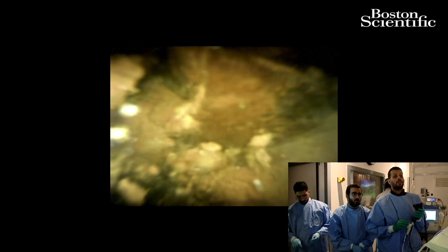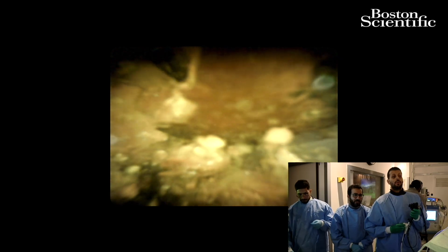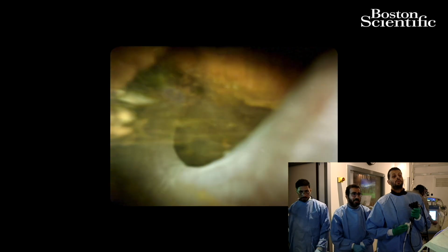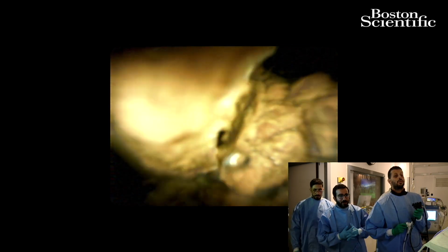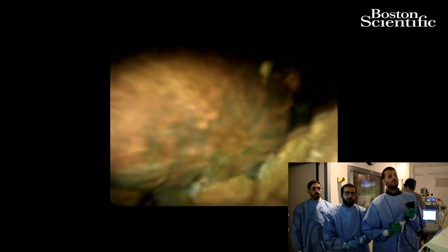So we are now almost at the bifurcation. I think we can see the beginning of the bifurcation here. Yeah. We'll just try to see whatever fragment we have here. Yeah, so that's the bifurcation. I think it's all now fragmented. So what we can do is just take off the cholangioscope and then sweep all these fragments out.